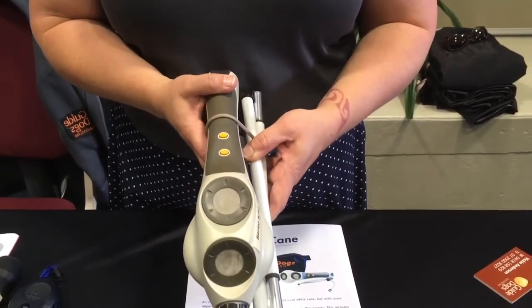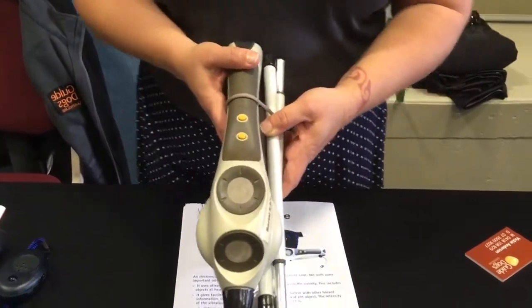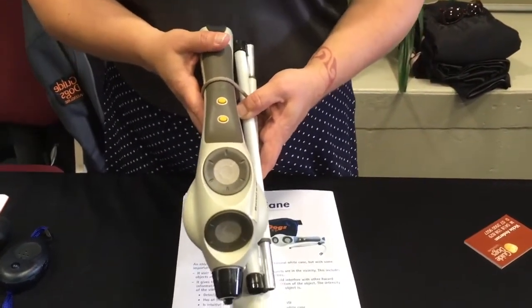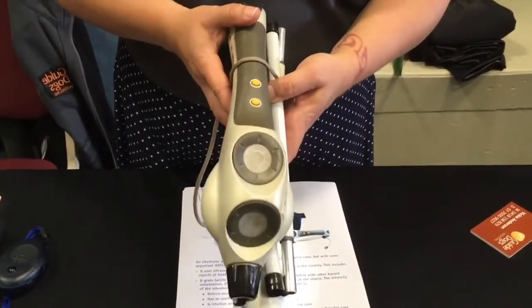No one-size-fits-all — do a bit of homework and see what works for you. So that's been the Ultra Cane. Thanks very much Vicki, and thanks for coming on the channel.